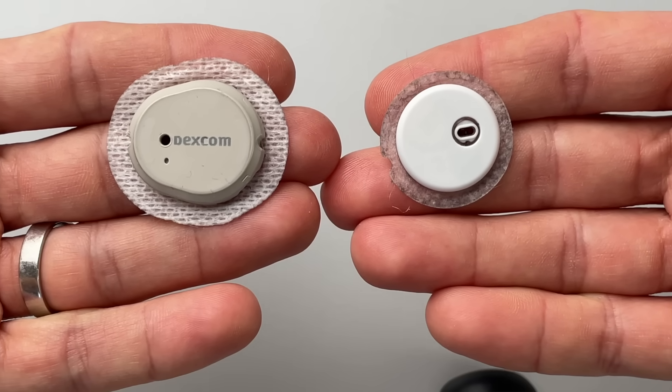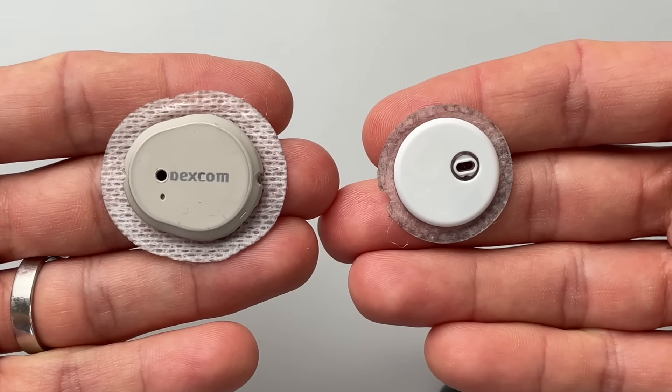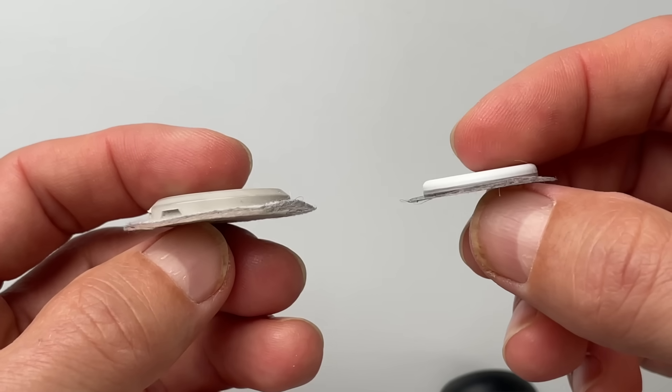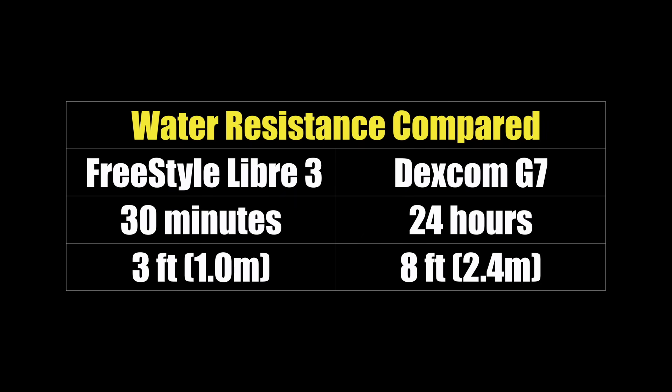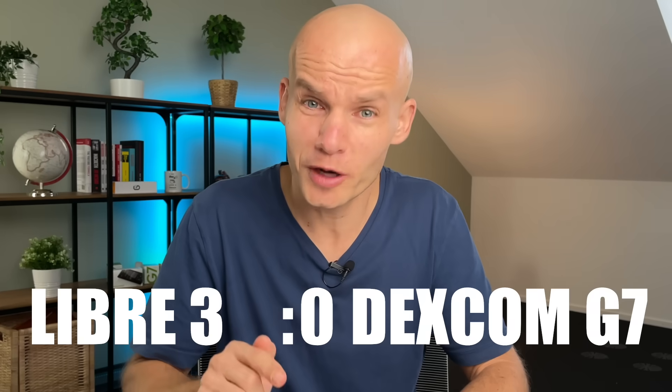The sensors also have slightly different colors — Libre 3 is matte white and Dexcom G7 is slightly grayish. Both sensors have a little hole in them, which is apparently used to regulate temperature and humidity around the sensor. They are both water resistant, so it's perfectly fine to shower or even swim with them. Libre 3 claims to be water resistant for 30 minutes, while Dexcom G7 claims water resistance for 24 hours when submerged under 8 feet of water. Overall, I think Libre 3 looks a bit better — it's smaller, sleeker and more convenient to wear. So I give this one to Freestyle Libre 3.